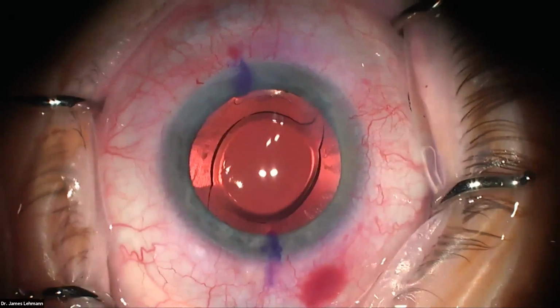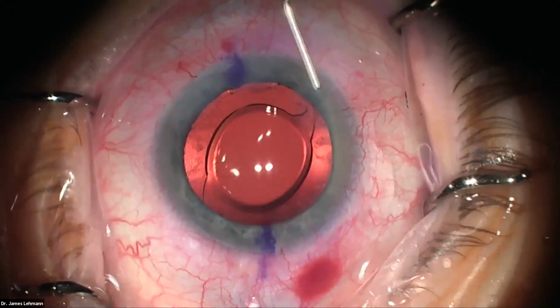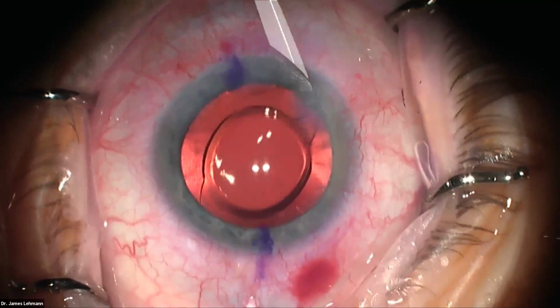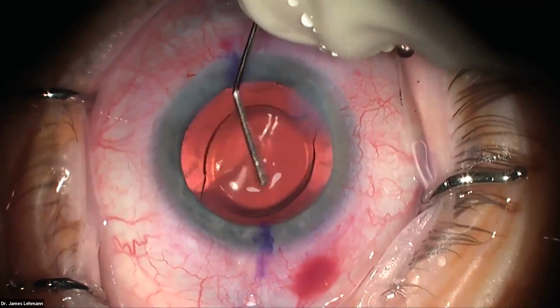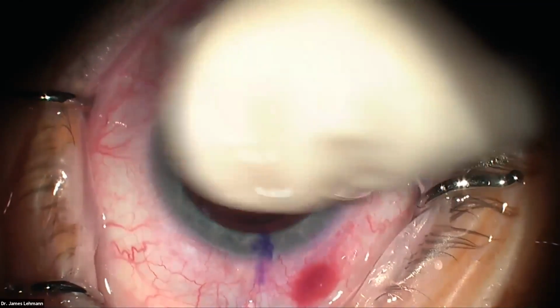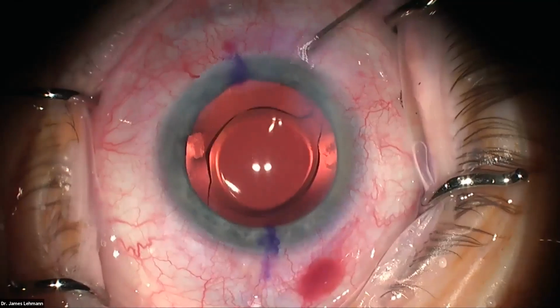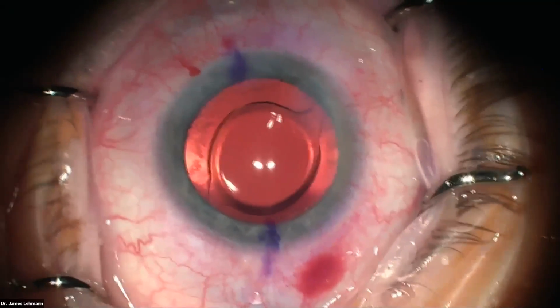So now we know we're in a good position here. I got 360 coverage of the rhexis. The haptics have expanded, and now I'm just going to fill the AC. I'm looking here at my wound to make sure there's no leakage. I feel like the eye's firm. No, could be a little firmer. And that's perfect. I'm a little too firm, so I'm going to remove that. So we're all done. I appreciate it, and we'll go take some questions.